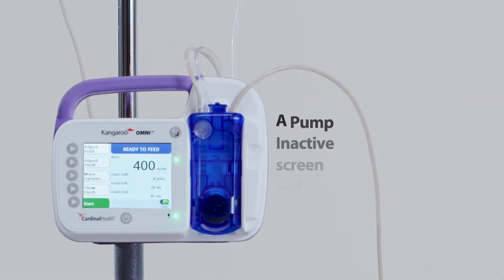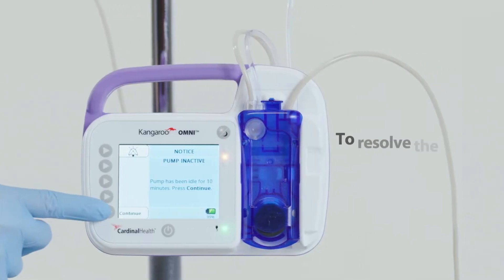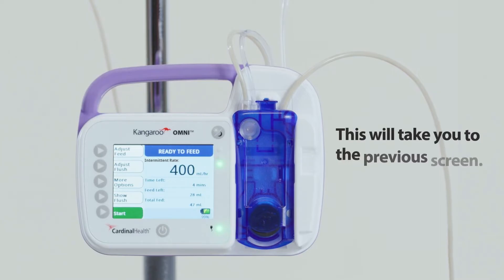Pump inactive alarm: a pump inactive screen will appear when the pump has not been actively running for more than 10 minutes. To resolve the alarm, press continue. This will take you to the previous screen.